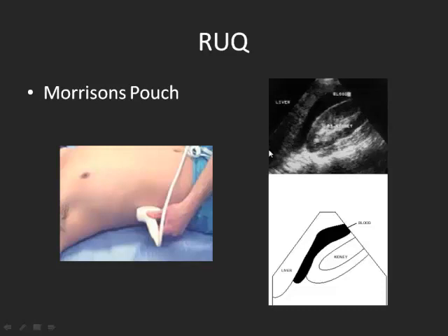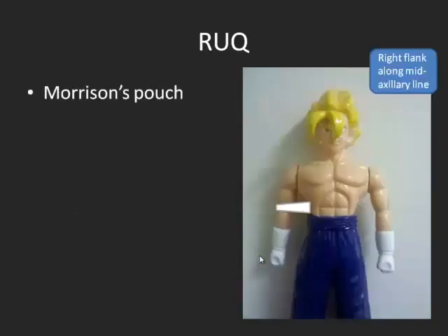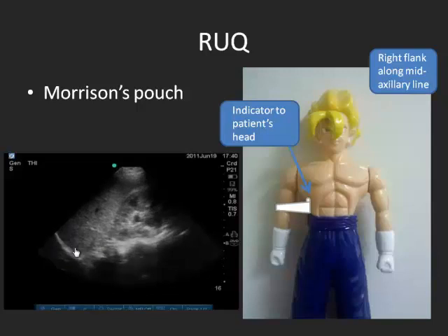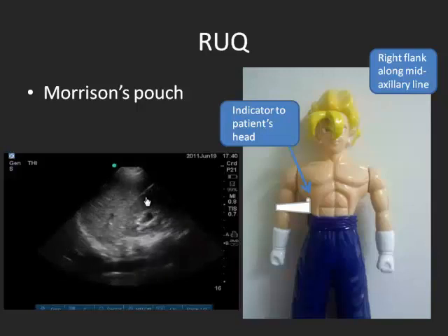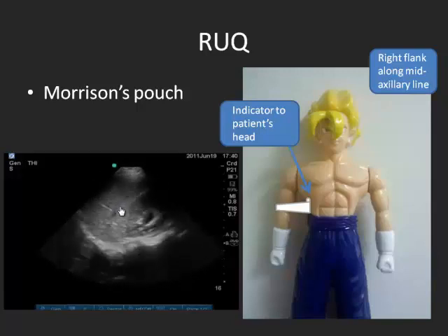This is Morrison's pouch. You can see here the kidney and the liver. You also want to get your diaphragm in view, though it's not showing very well here. This is what fluid in Morrison's pouch looks like. To do the right upper quadrant ultrasound, take your probe on the patient's right flank — your indicator is going towards the head, on the long axis. You can see here the diaphragm and the lung, which is why it almost mirrors. Right here is the area of interest, Morrison's pouch. Most studies say that if you just look at Morrison's pouch, you can catch most intraperitoneal fluid or hemorrhage in acute trauma.